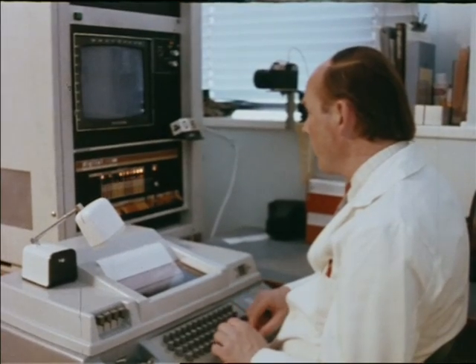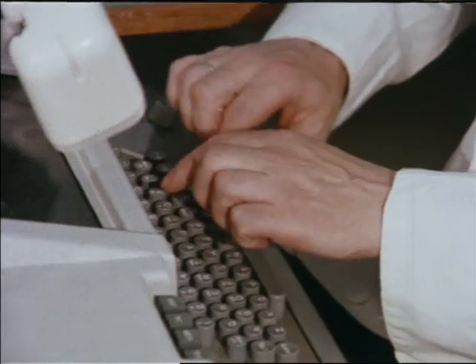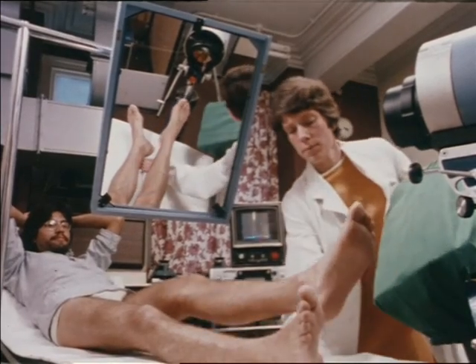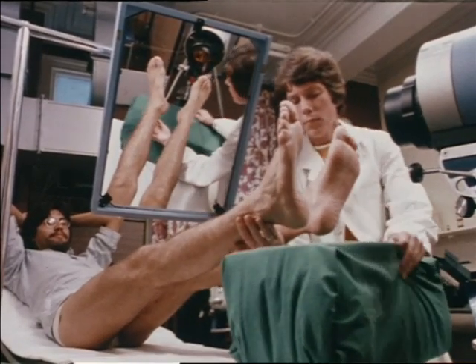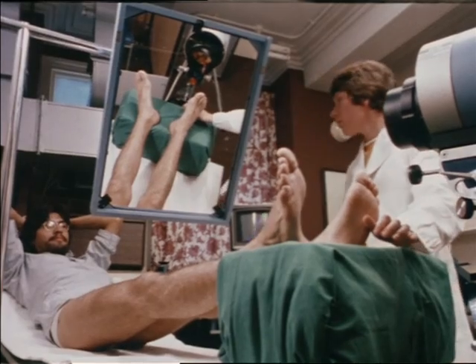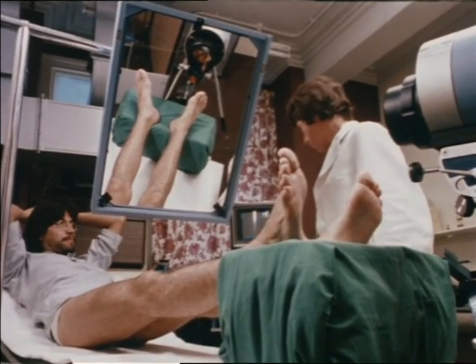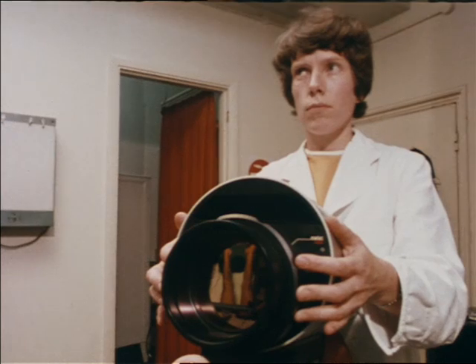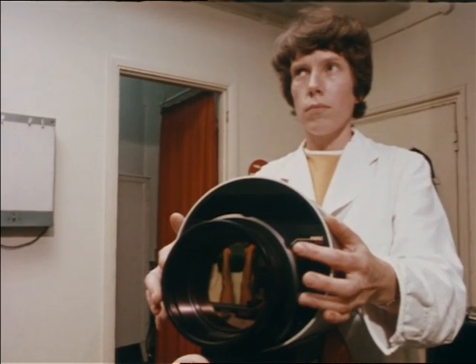By allowing us to measure inflammation, a process within the body, these colourful heat images are giving us the first objective test of a range of different drugs. Elsewhere, thermography is now in regular use. In this London hospital, it's being used to screen patients after surgery. Such patients risk having deep vein thrombosis, a blood clot in the leg which can prove fatal. But a thermogram can detect the danger.